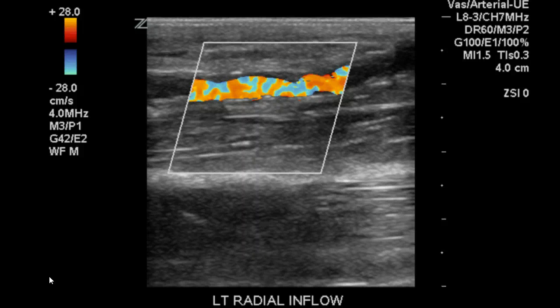In this case study of a radiocephalic arterial venous fistula, we are hoping the exam gives us insight into whether or not the access is working, or if there are any reasons it might not be functioning properly. We are looking for any areas of flow-limiting stenoses, patent side branches, or evidence of inflow or outflow disease.